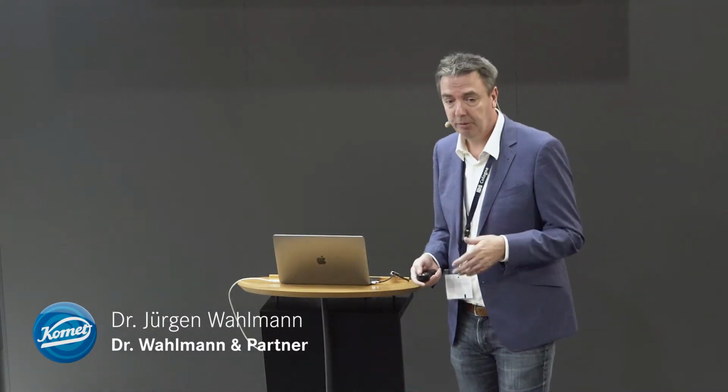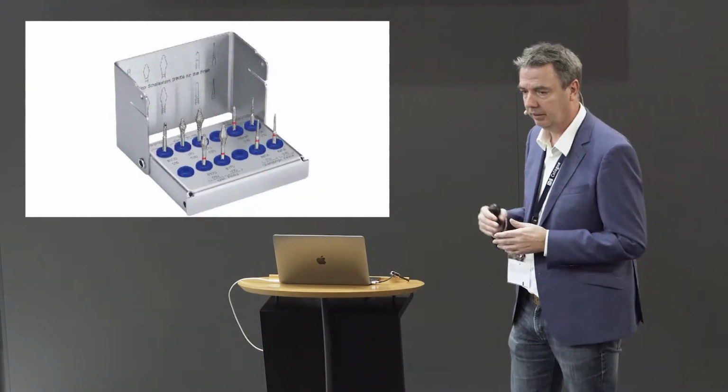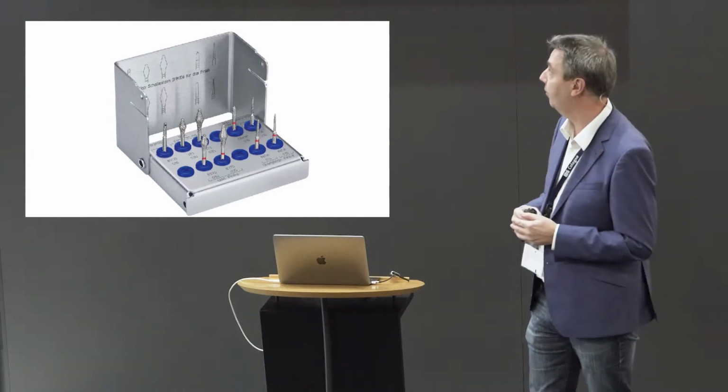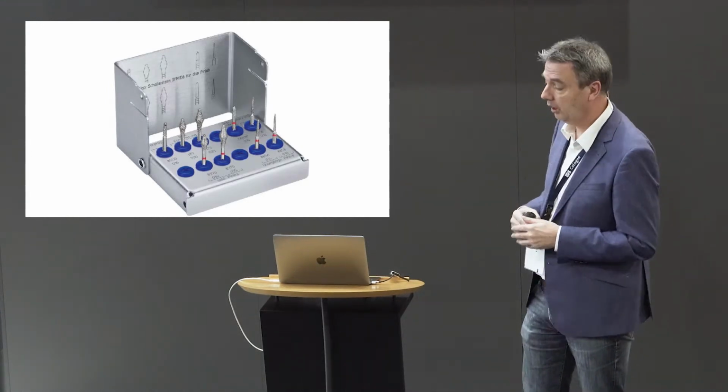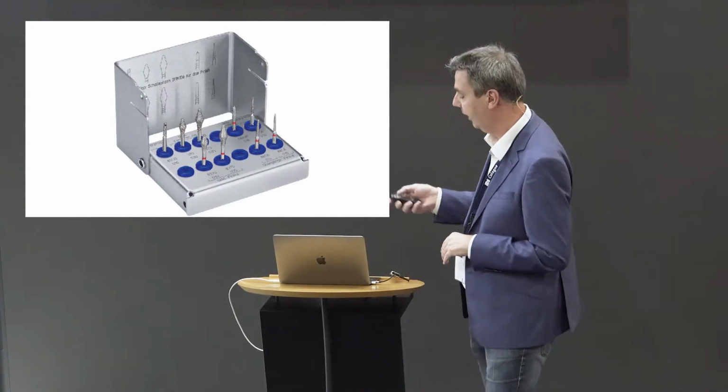If we do tabletops, and I always try, if it's possible, not to do a crown, to come back to the key point of the lecture. If it's possible, I just love to preserve the tooth structure of the patient. And there's a brand new kit on the market. This is developed by Dr. Ahlers and Dr. Edelhoff. This is especially for tabletops, and everything is inside the kit.